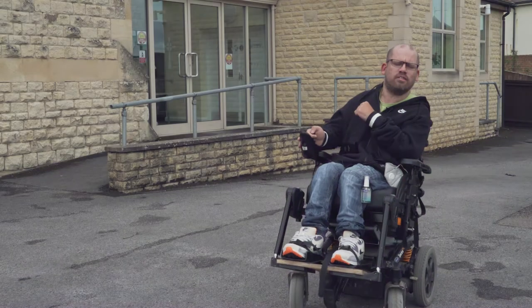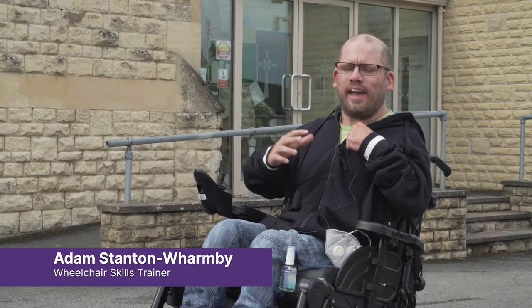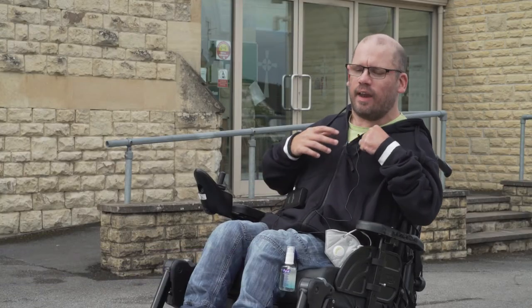Hi, I'm Adam and I'm a wheelchair skills trainer for Whiskids, here today teaching you about safety while using your wheelchair. You get given these amazing wheelchairs to enable your independence and freedom, and so it's our job to make sure that you can do that safely.